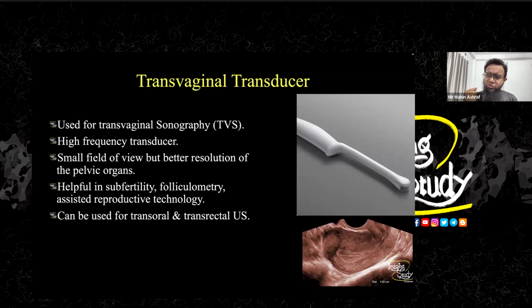I put the transducer over McBurney's point, I put a little pressure over there, and I can see it in very good resolution. So it's actually a type of curvilinear transducer using the high frequency of a linear transducer. So it's a combined probe. That's why you can use it for many different purposes if you are very clever.